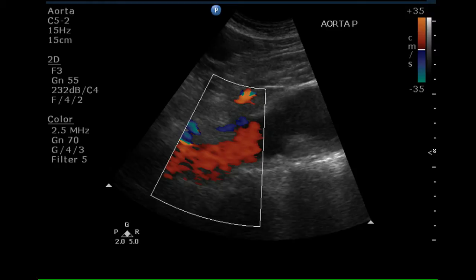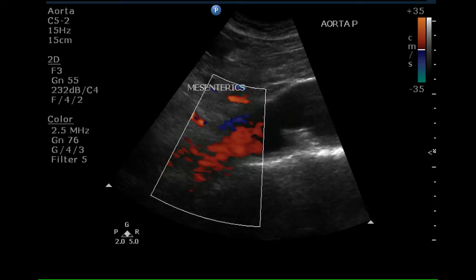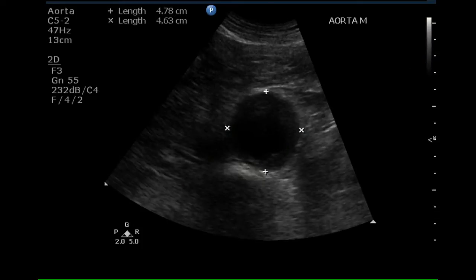Just inferior to this portion of the aorta is the beginning of an aneurysm. The origin of the SMA is indicated on this image above the level of the aneurysm. The diameter of the middle portion of the aorta is increased, the maximum dimension being 4.8 centimeters, consistent with abdominal aortic aneurysm.